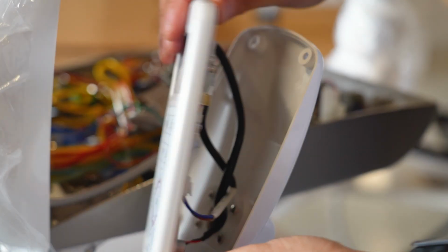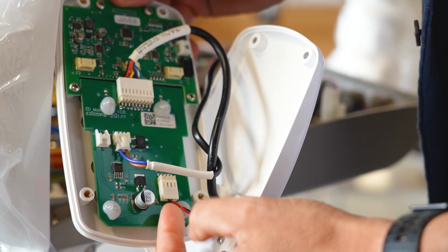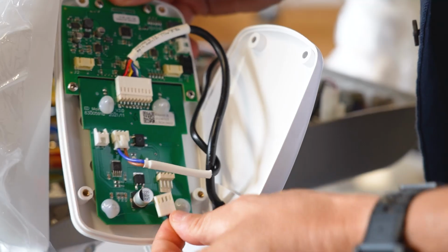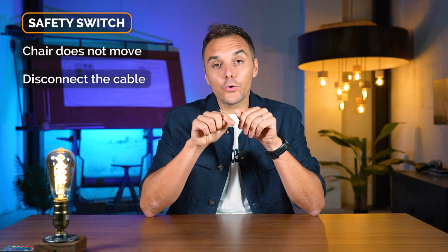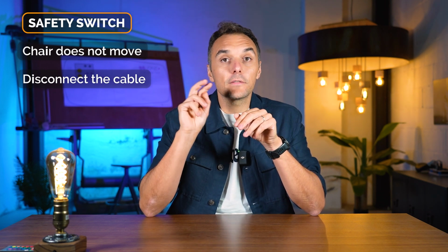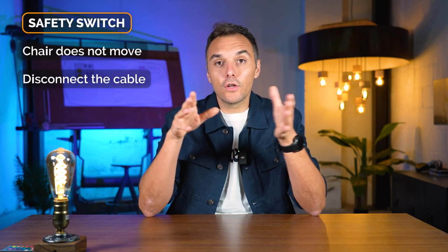The first one, it can be that the activation switch that is installed on the main board of the control panel on the doctor side has some fault. So we need to disconnect that cable and see if the chair is moving itself. If the dental unit is not moving at all and when you press one of the buttons for the movement it is giving a sound only, so it gives beep beep, and that's it. So the chair is not moving at all.